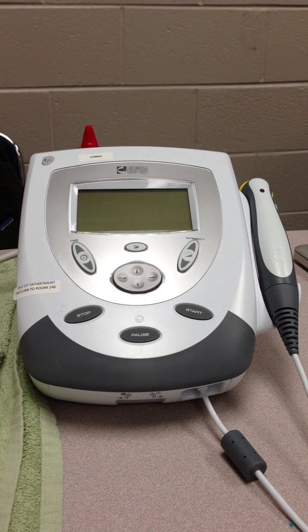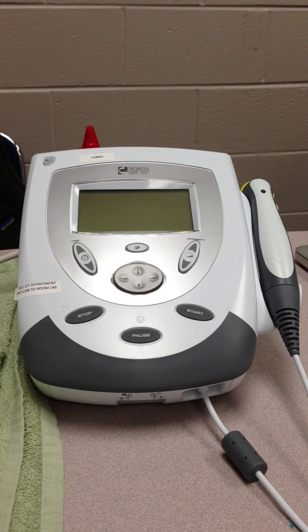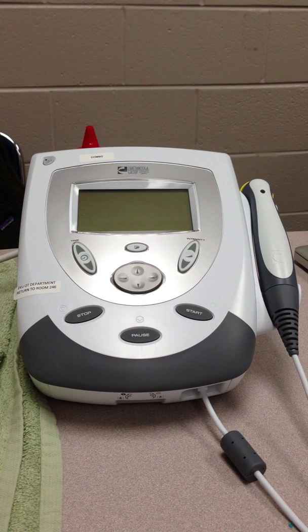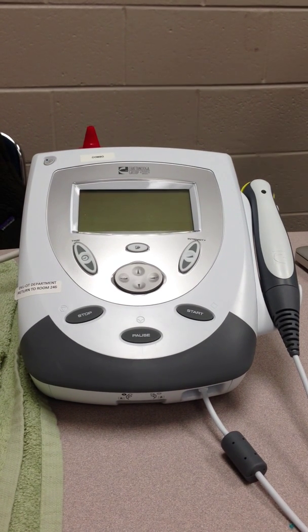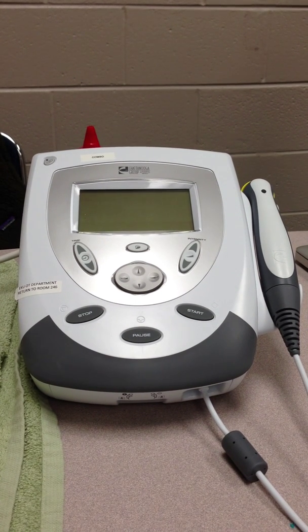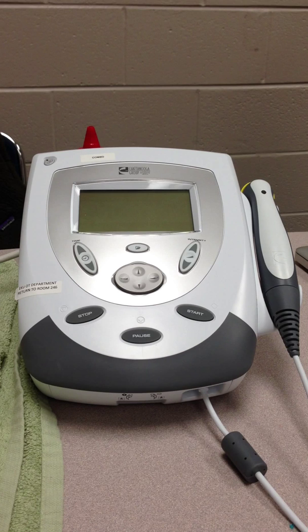Instructions on where and how to apply. Perform patient exam prior to intervention. Turn on and check the ultrasound equipment. Instruct the patient about the procedure and what is to be expected. Position drape accordingly while leaving treatment area uncovered. Identify the area to be treated.